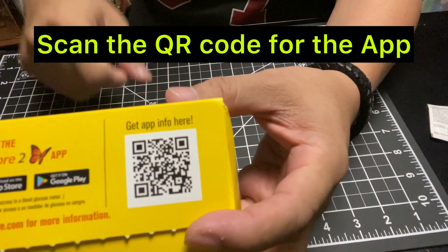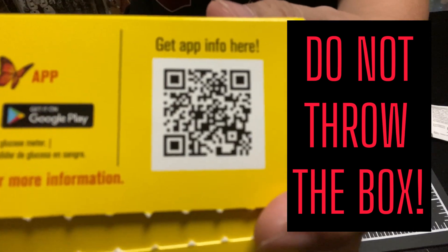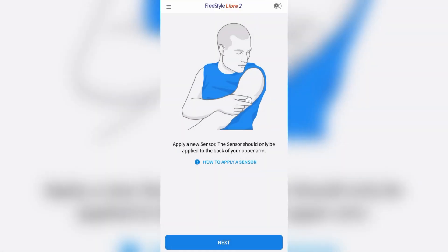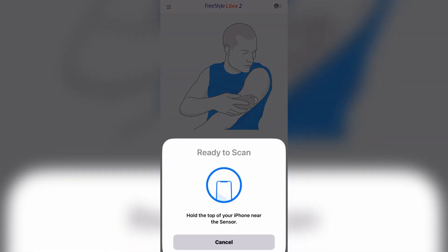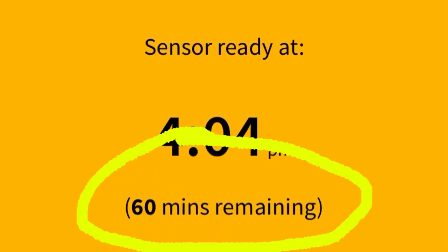Scan the QR code from the box to download the app. Do not throw away the box or the plastic parts — you will use these to dispose of the probe sensor part. The app will ask you to scan the sensor and it will take 60 minutes for the initial reading.